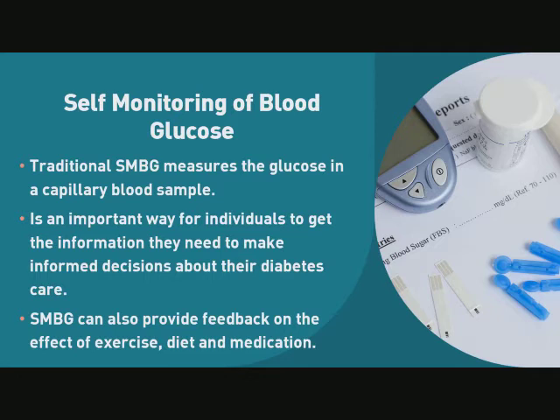So it's very important for us to have a glucometer. Glucometers are everywhere, available in the markets and the pharmacies. Many companies are producing glucometers, and all of them do the same basic function required, which is determining the level of the blood glucose. They just differ from company to company because the manufacturers are competing by adding special features.